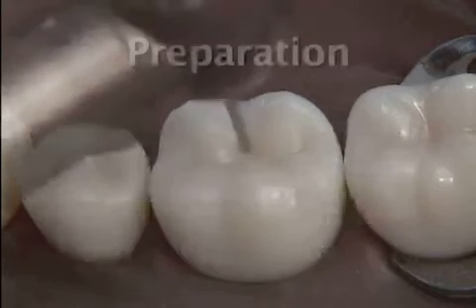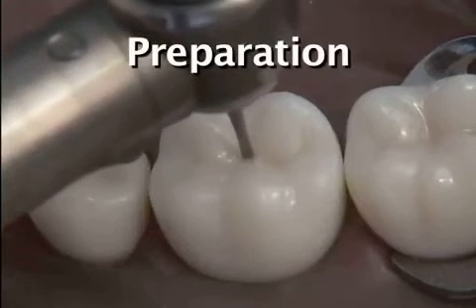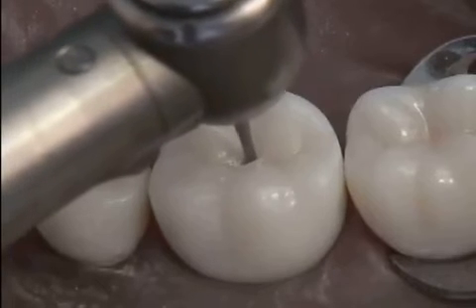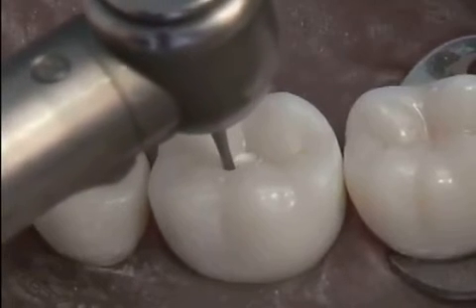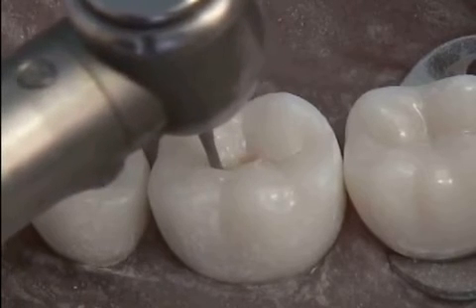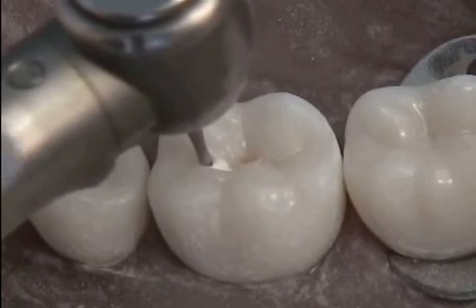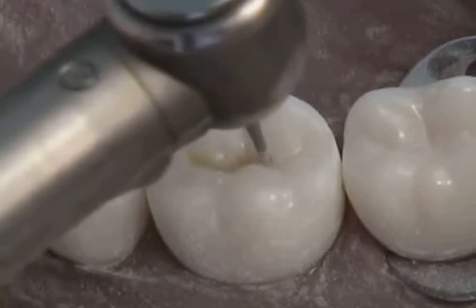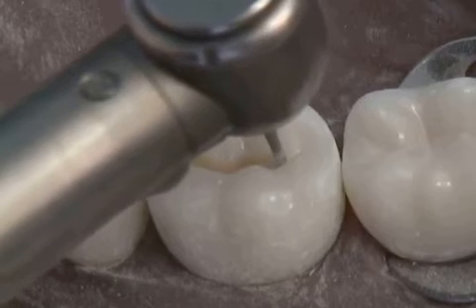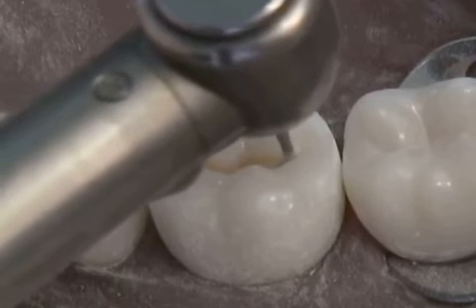First, we want to utilize a carbide or diamond burr in a high-speed handpiece to create the initial punch cut where the caries is the worst, usually at the central pit. A good guideline is to drop somewhere between half and full length of a 245 burr, which is just shy of 3 mm in length. This will put you just inside the dentin layer on an average occlusal surface.